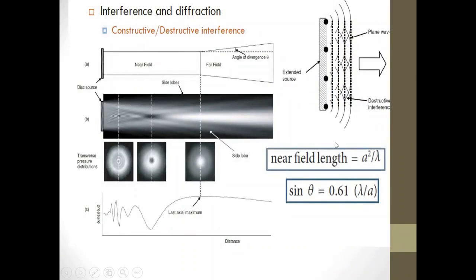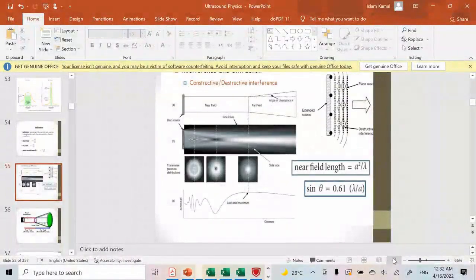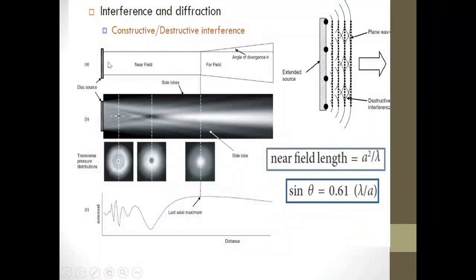So far, there is no problem. Two, you see this panoramic view? As you can see, this is the bottom of the transducer. What is this view? This view represents the shape of the beam coming from the transducer.